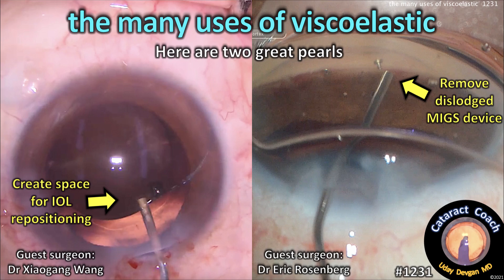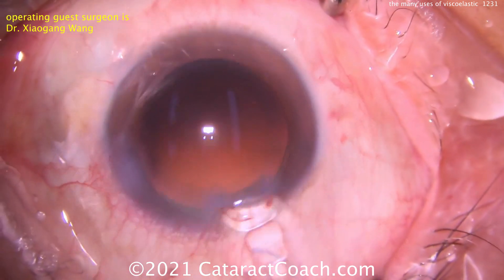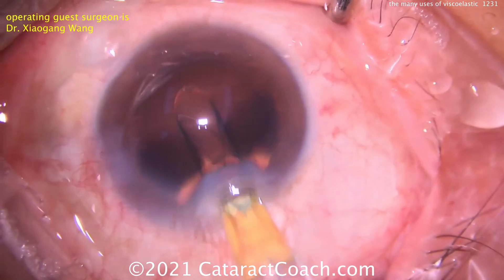cataractcoach.com. The many uses of viscoelastic. Here are two great pearls from two different guest surgeons — I think you'll like these. Our first guest surgeon is Dr. Xiaogang Wang, and he's going to show us iWell insertion.